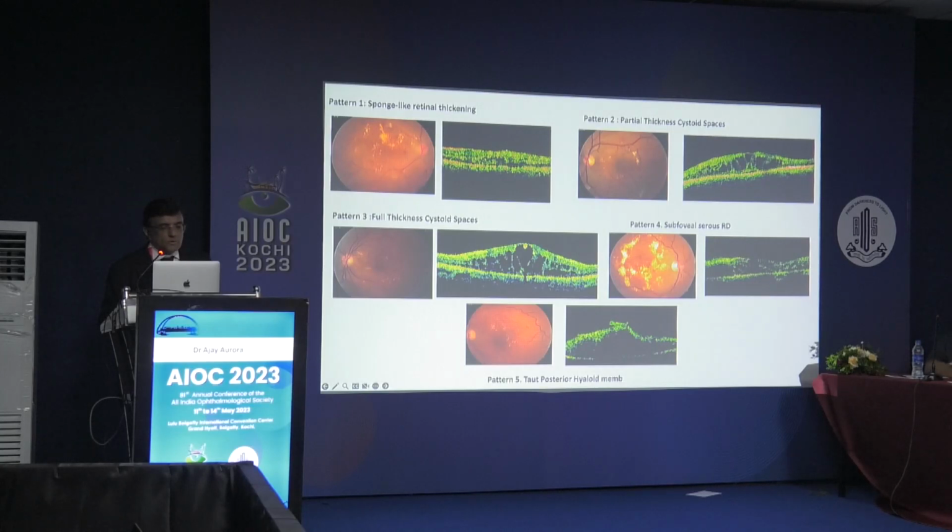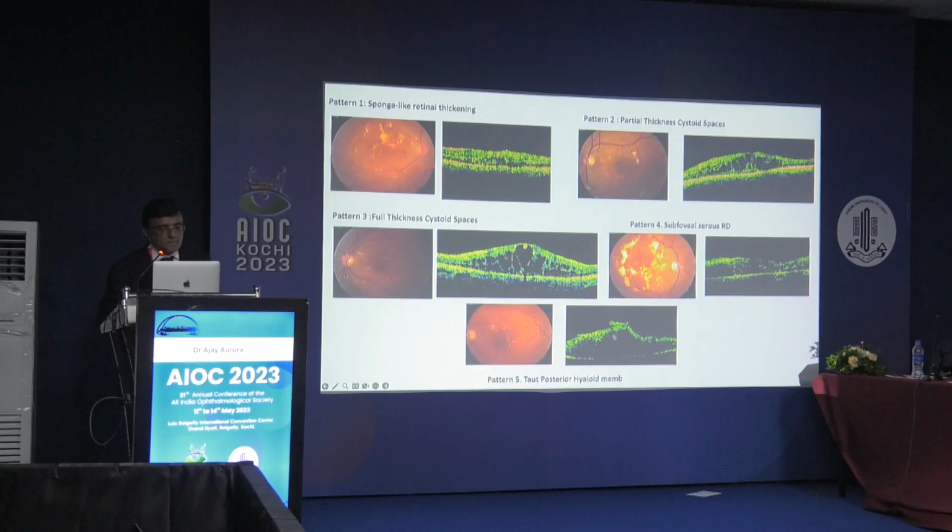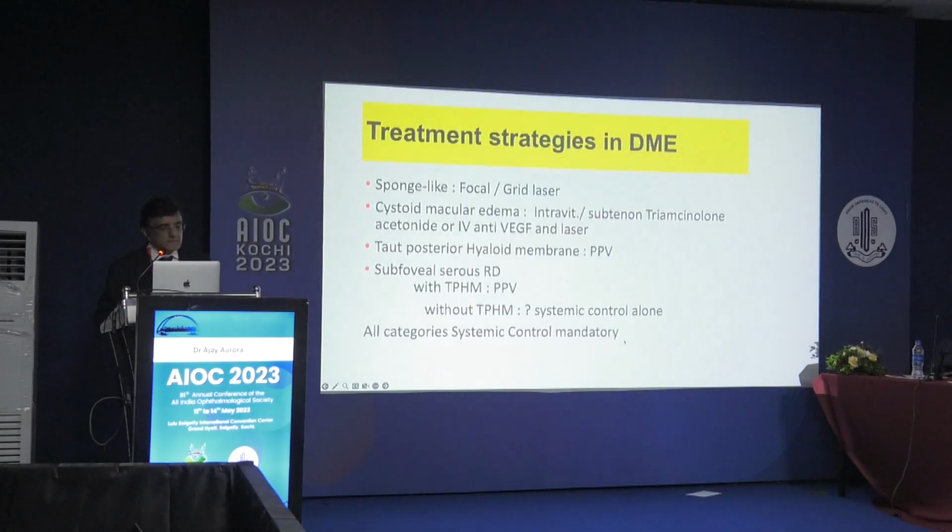And if you have a small neurosensory detachment, you must do kidney functions. If you have a sub-foveal CSRD, you must do kidney function in these cases. And in these cases now, as I'll show you subsequently with the better OCTs, the inflammatory markers or diabetic retinopathy. And then if you have a patient who has a tractional edema, so this was a long time back, Stratus OCT, we will now go back to the spectral OCT. And this led us to the various treatment protocols depending upon this.